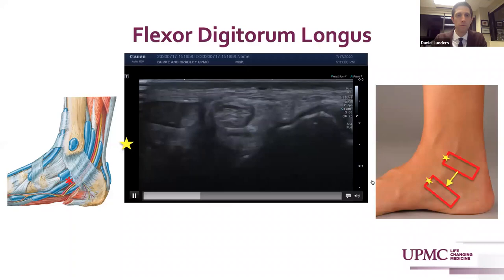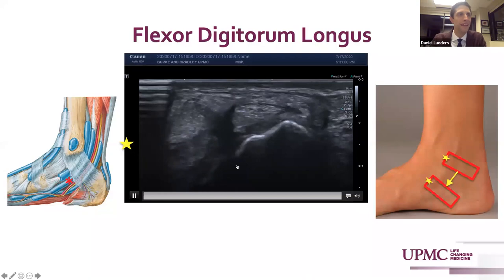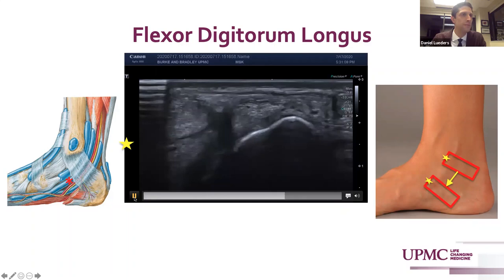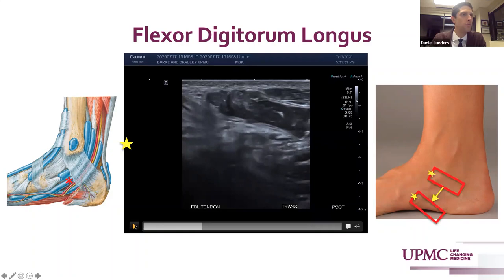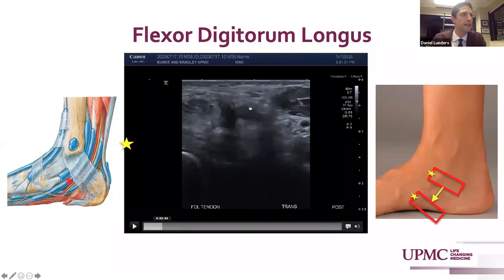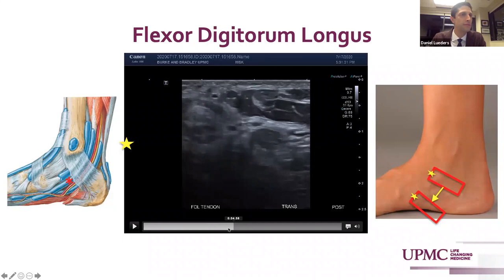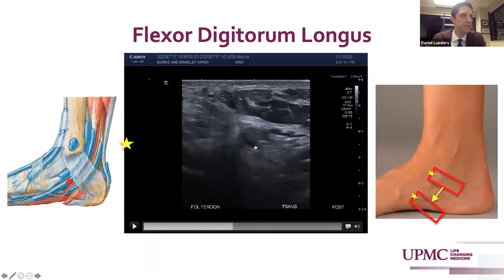Flexor digitorum longus courses through the tarsal tunnel posterior to the posterior tibialis tendon, then distinctly sits adjacent to the sustentaculum tali. It then moves into the plantar foot and traverses deep. It's important to wag your transducer to eliminate anisotropy and distinguish that tendon. At the medial foot it has an intersection at the master knot of Henry with the flexor hallucis longus — a potential site of tenosynovial irritation and pathology in the medial foot. The tendons are differentially anisotropic — the flexor digitorum is more superficial, flexor hallucis longus more deep — and sitting just posterior to that is the lateral plantar nerve, which can be involved in a tenosynovitis process and may develop some neuritis.